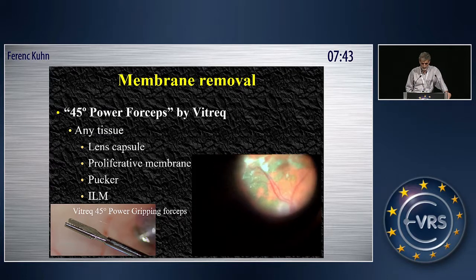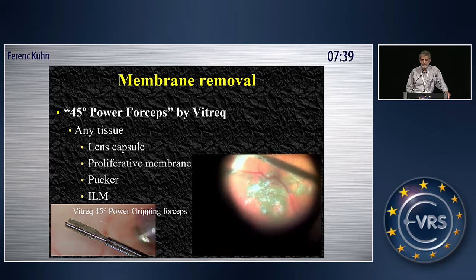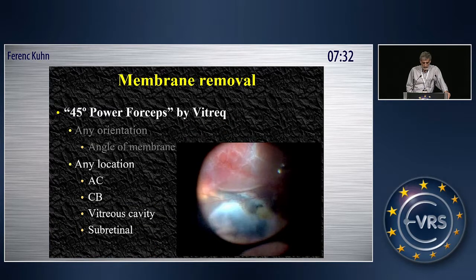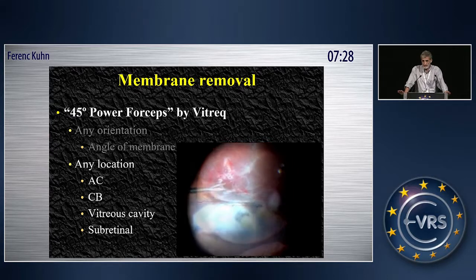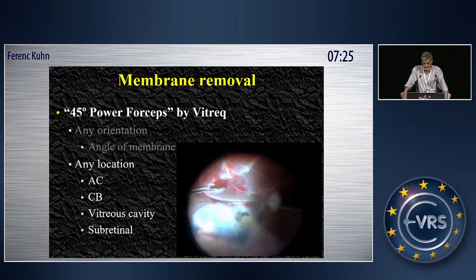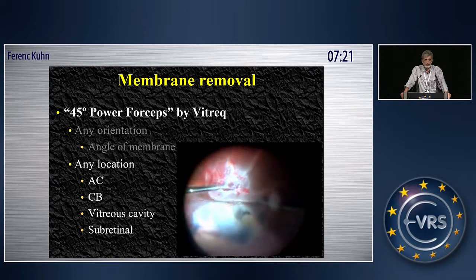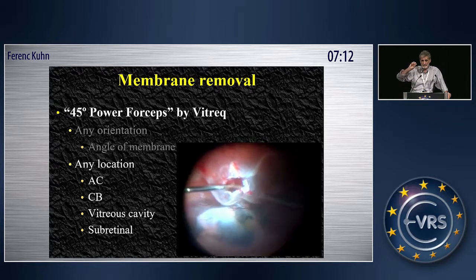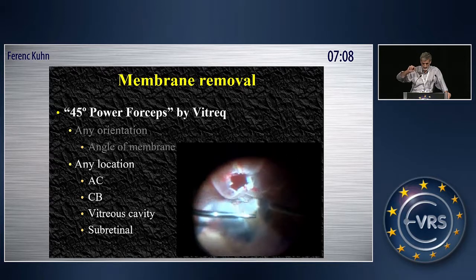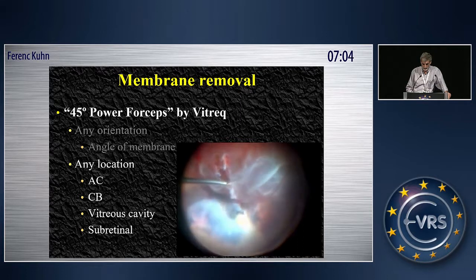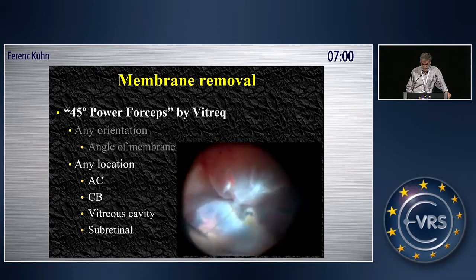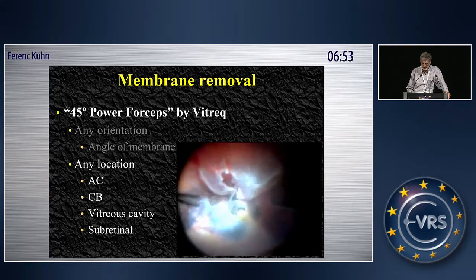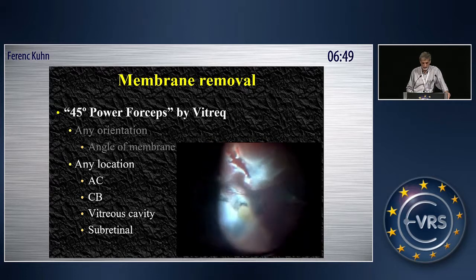Taking the ILM in the posterior pole is very important. Membranes in front of the retina and membranes under the retina also need to be addressed. The reason I came up with these forceps is simply because many of the subretinal membranes have an orientation where traditional forceps will not have enough traction. With these forceps it doesn't matter, so if you deal with cases like this, I suggest considering using them because you will not have an issue about the quality of the tissue, orientation, texture, etc. You will be able to get all of them.